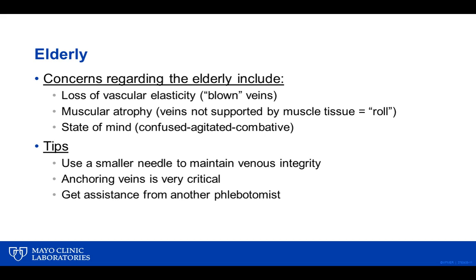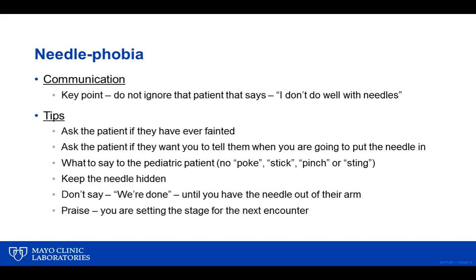Needle phobia is another one. You get a patient that has a needle phobia. One of the things you want to ask, and you hate to, but ask right away so they don't get injured: have you ever fainted before when you've drawn blood? So you can lay them back. If you're doing outpatient, you can lay them back in the chair or something like that, elevate their legs to help them so they don't faint this time.